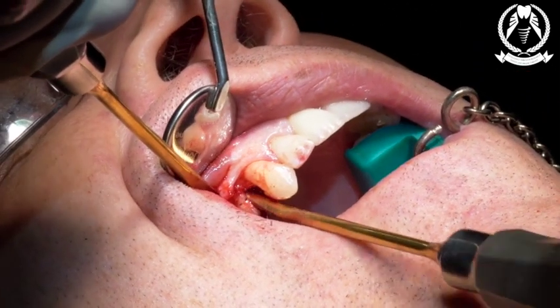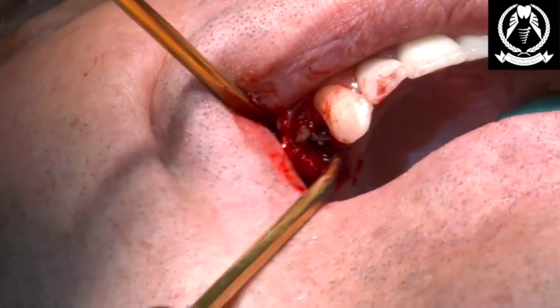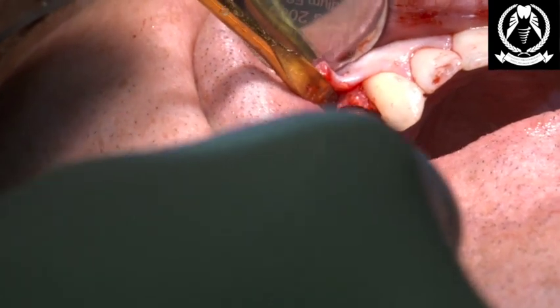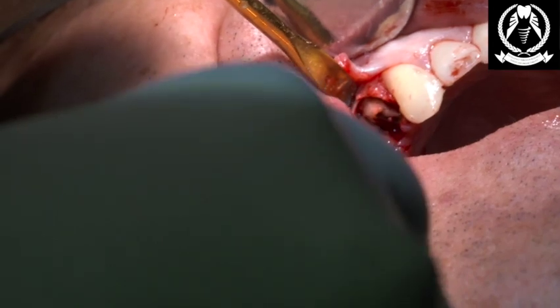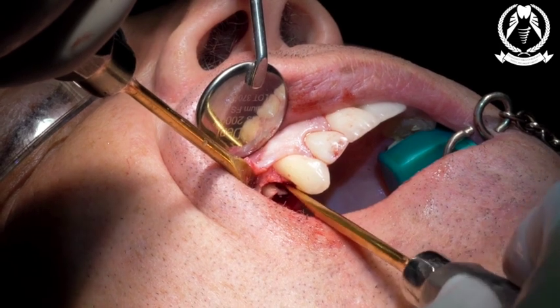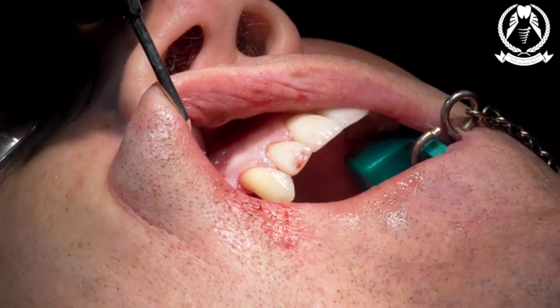Right, and then it goes again. Right, so I might need a fast hand piece at this stage. So, okay, so we have a premolar that's breaking now. So we need to now divide the tooth up a little bit, right? So slowly but surely into this socket. And slowly manipulating that root still there. Till we should technically be able to deliver it now, but we'll see how we go.